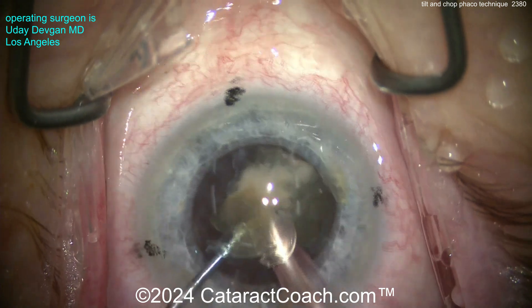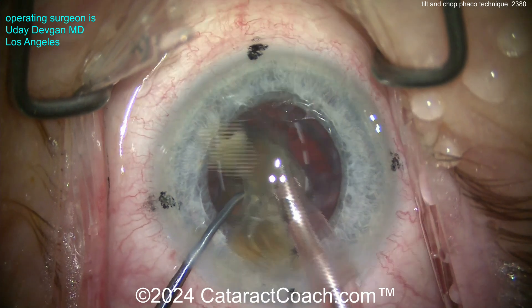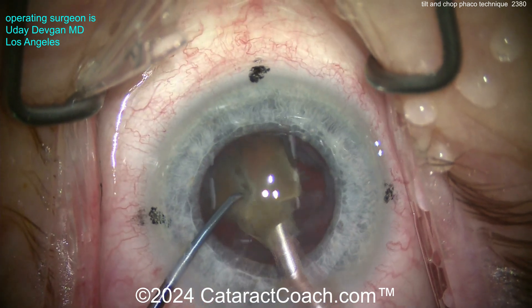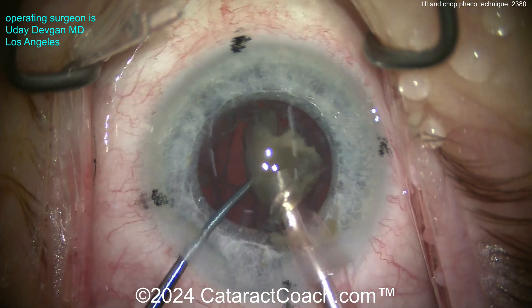Chop the last piece into even smaller pieces and emulsify those as well. This is a pretty typical cataract — not your typical soft California cataract, just a pretty average nuclear density. As the last piece comes up, we prepare for the final steps.